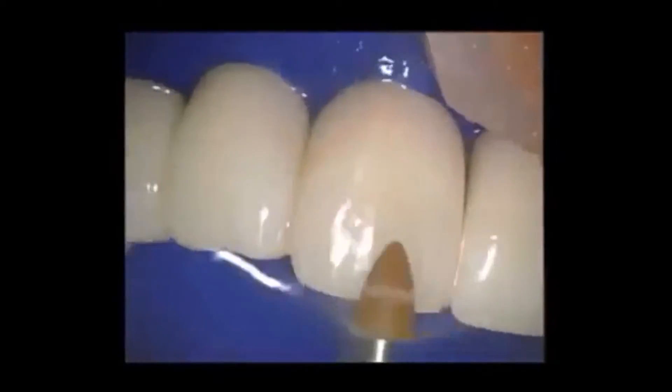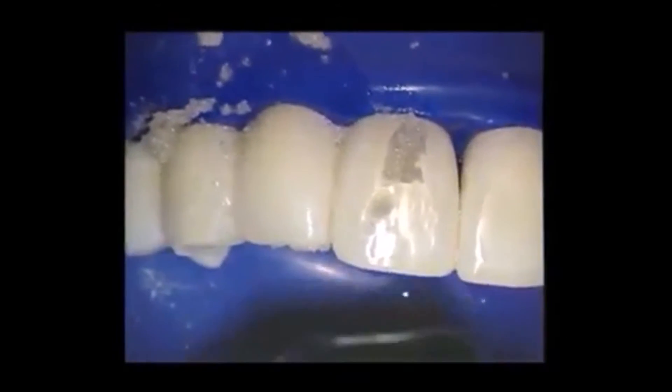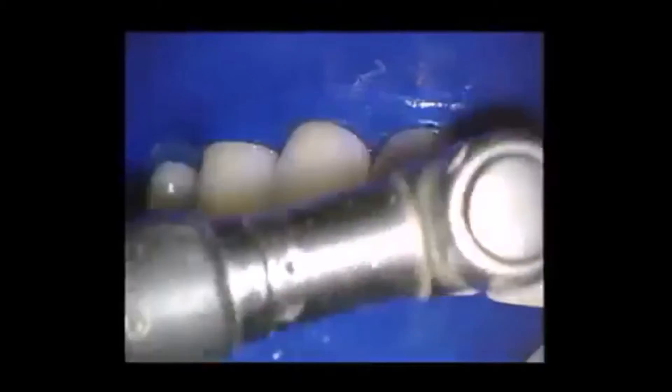Here are the three steps. Number one, we use a brownie at about 12,000 RPMs with water. Next, we use coarse pumice — that gives us a nice matte finish with omnidirectional scratches; we don't want all the scratches going the same direction. The third thing we use is the jazz polisher. We're going to use a lot of heavy pressure with the jazz polisher — you should be able to push the patient's head down with it. The finer the polisher, the more pressure I use. That creates a lot of heat, so once again we've got to spray the tooth with water.